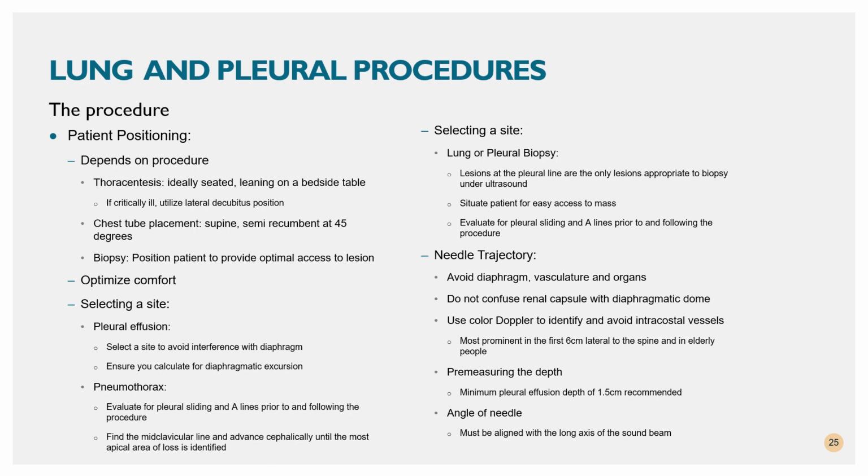The procedure and the patient position is really going to depend on what you're doing. I mean, you could be doing a biopsy, a thoracentesis, a number of different things. So obviously the patient position is going to be very different depending on what you're doing. So the most important thing is that you're going to optimize the patient comfort.